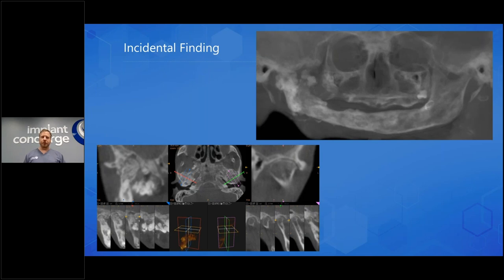This came to me from a hospital here in town, and that was kind of where they're leading, that they might have it, because I followed up with the doctor, because anything this severe, you want to get the report out as quick as possible. That is a possibility, a secondary diagnosis, but Dr. Robel was really thinking that this was a necrosis from radiation therapy, because you can also see it's not just in the condyle. I went over this a little quickly, but you can also see on the right posterior part of the maxilla, there's something going on there as well. A good answer.